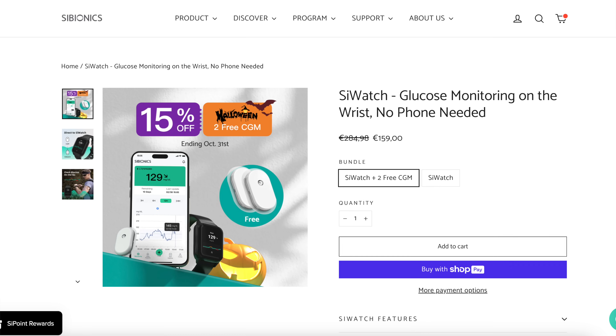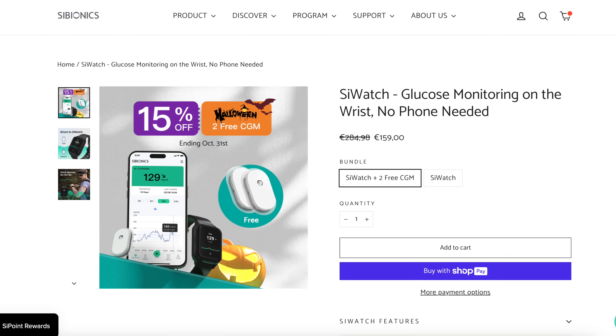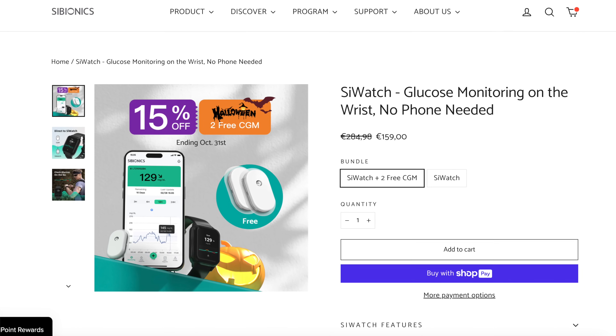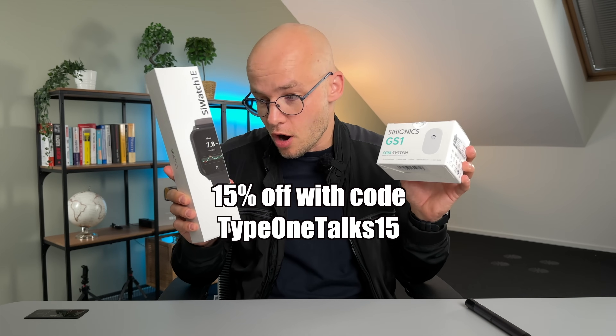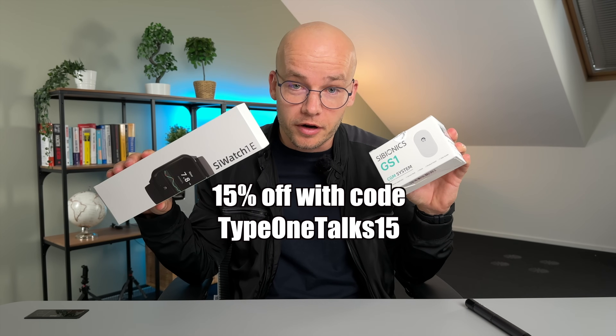If the freedom from your phone and the direct-to-watch feature sounds exciting to you, you should know that at the point of filming this video, Cybionics is the only system that allows direct-to-watch for both Android and iOS — no other system can do this right now. The Cywatch currently sells for 159 euro, which is around 170 dollars, plus you get a free CGM sensor in the package, which is a really good deal. The Cybionics CGM system is CE marked in Europe, but it hasn't received FDA approval yet, so unfortunately they don't ship to the US.